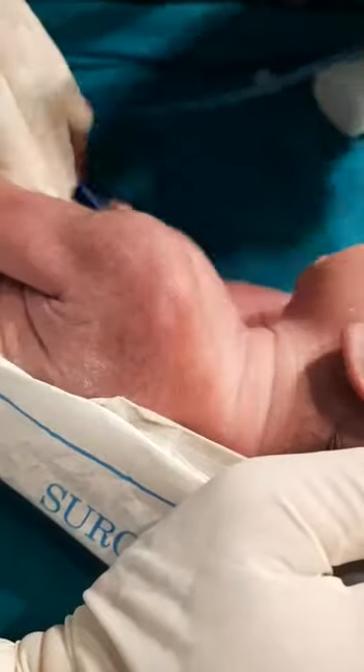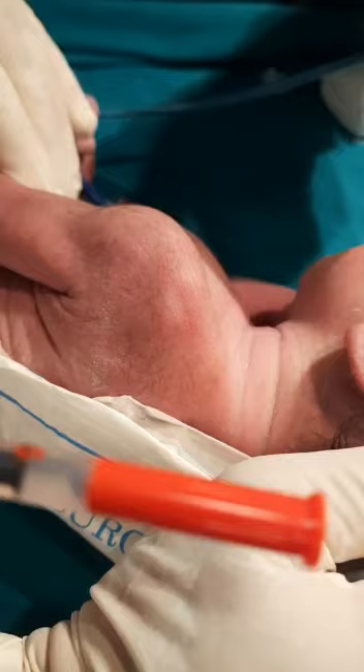Good morning everybody. This is the way we are giving BCG vaccine. You can see in the syringe I have loaded 0.1 ml, but I'm not going to give 0.1 ml to this newborn baby — I'm going to give 0.05 ml.